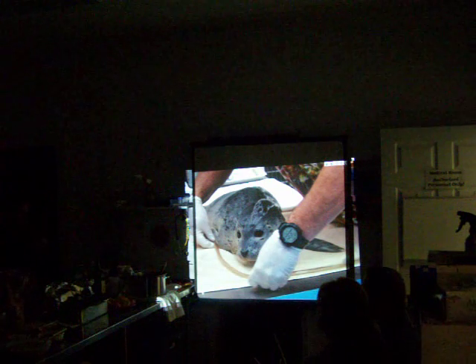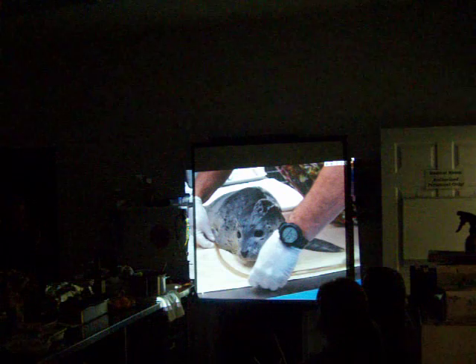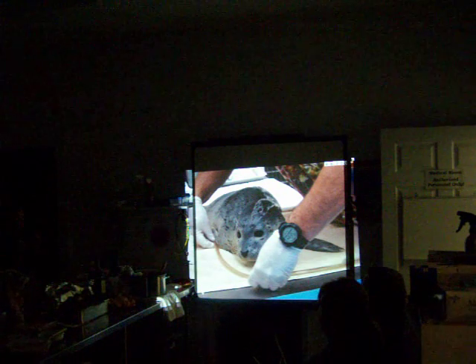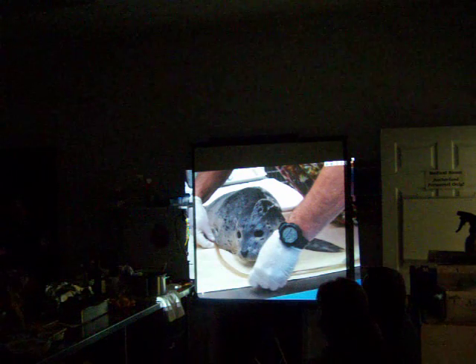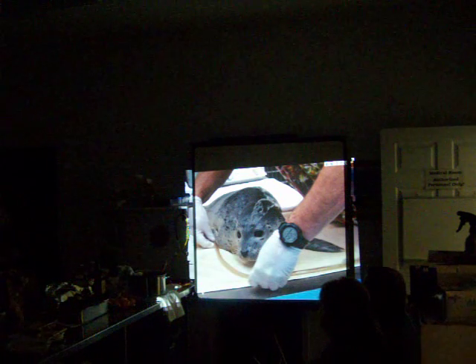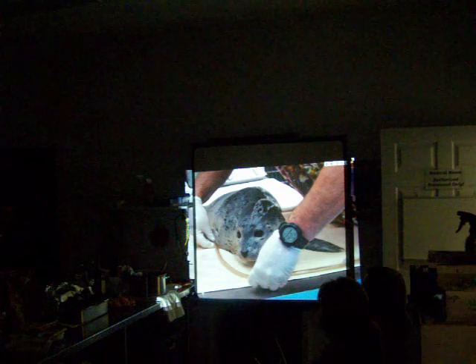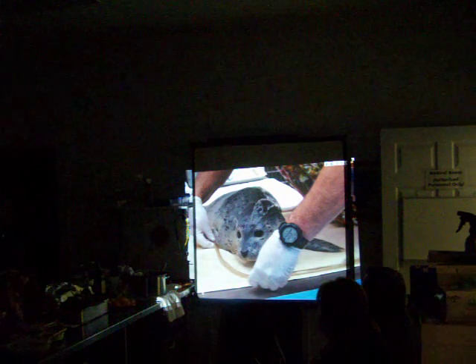And we have a rubber band on the tube, and you put that at the point that you want it to stop at the mouth. Does that make sense? And that's your measurement, and you do that every time that you're feeding an animal. I thought maybe because the rubber band was here that meant it was already measured. You measure it every time.